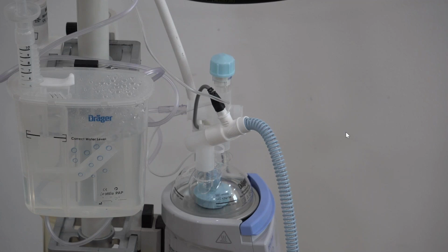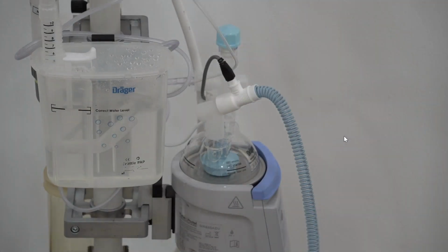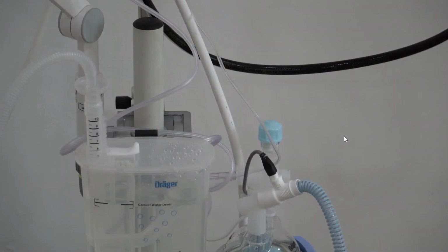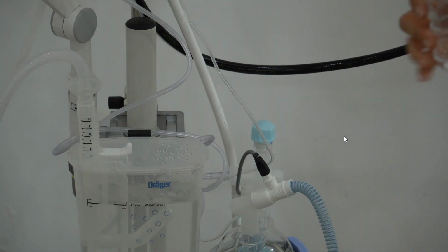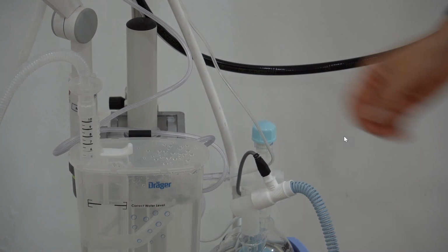Okay, so there is a question. Could you demonstrate how to top up water into the white container? That is an excellent question. Let me just move the system a little bit further. I'll move the camera up a little so you can see it a little bit better. It's actually very simple. Obviously I'm using this bottle of water, but you would use the water that's available in your hospital.